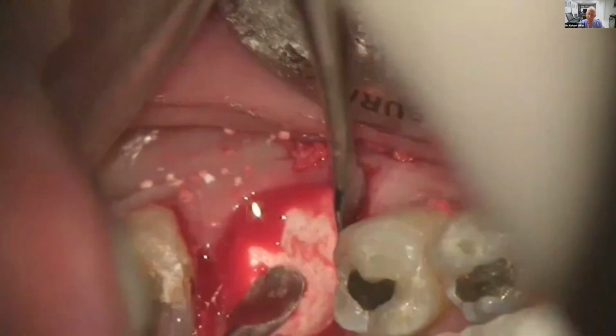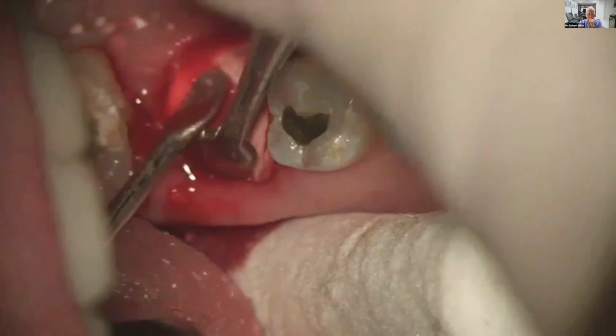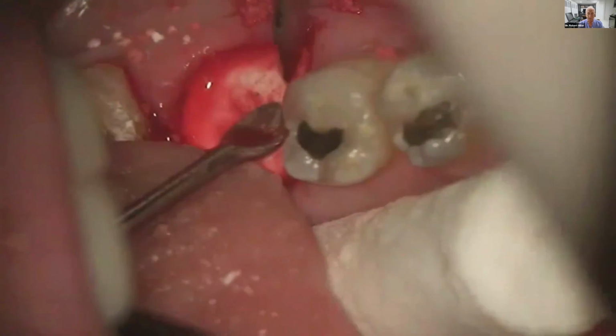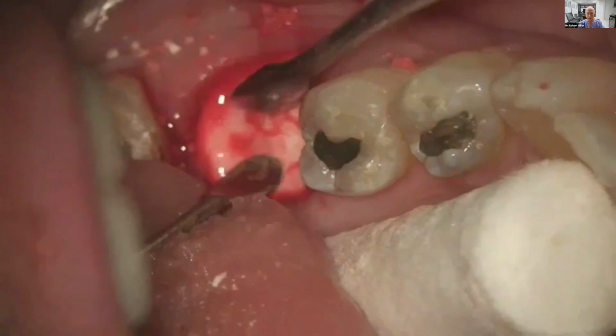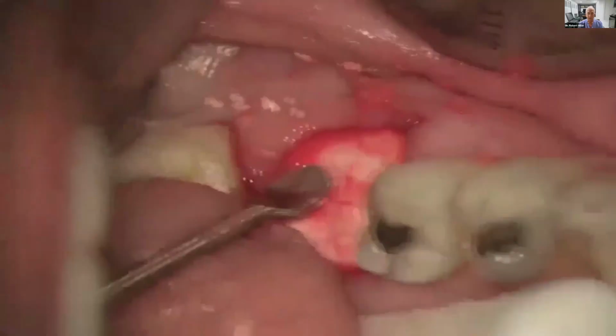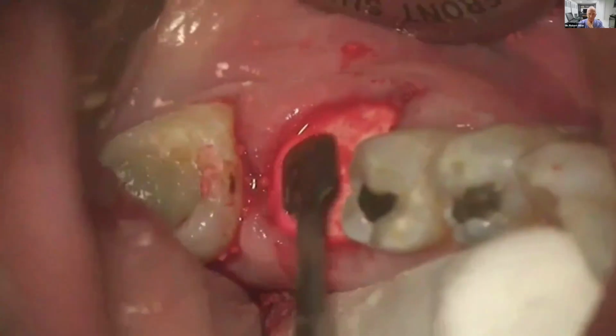Because it's going to take, with this material, probably 3 to 4 weeks for that tissue to close over the top of this. But if you've got good surgical skills, you've got a good experience doing this, you can get a pretty decent result, but you have to wait for everything to heal. So here we are covering with a collagen membrane, and then we use a nice suture technique, which is horizontal mattress suture that goes over the top. I'm going to skip the rest of this, right?